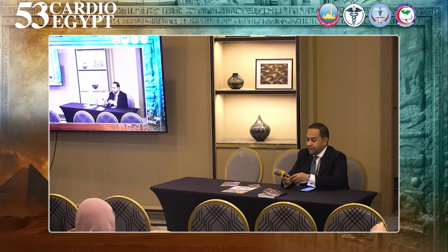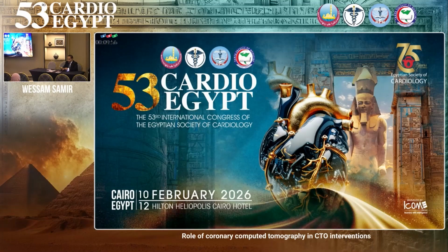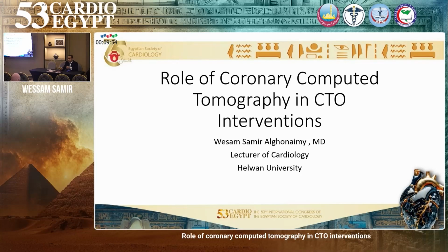Thank you, Mr. Chairman. Good morning, everyone. My talk today is about the role of coronary computed tomography in CTO interventions.